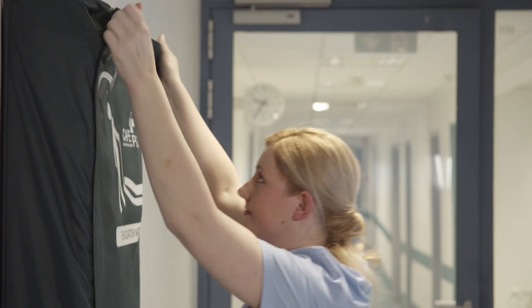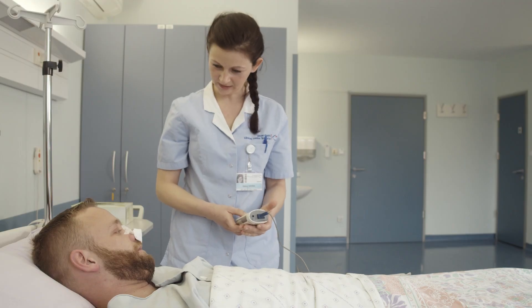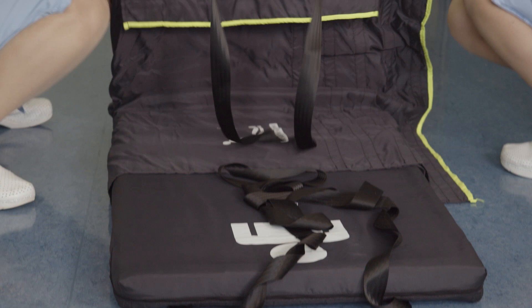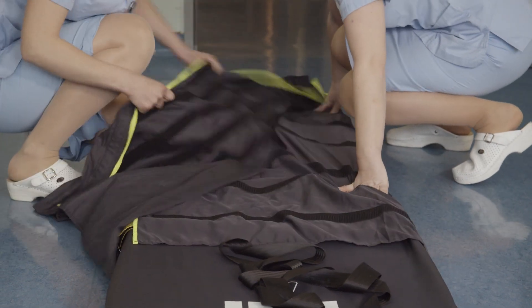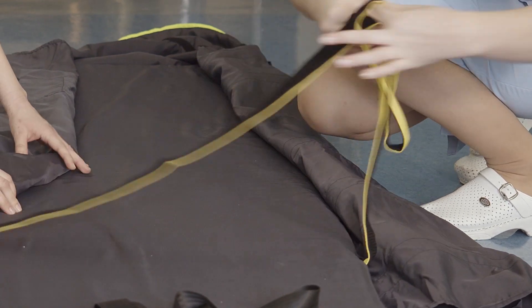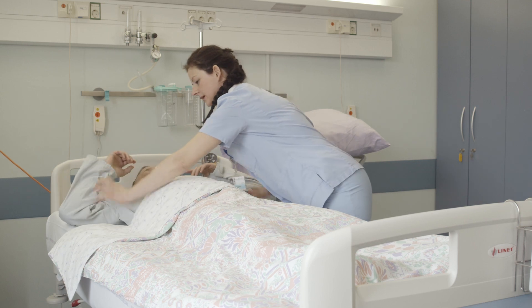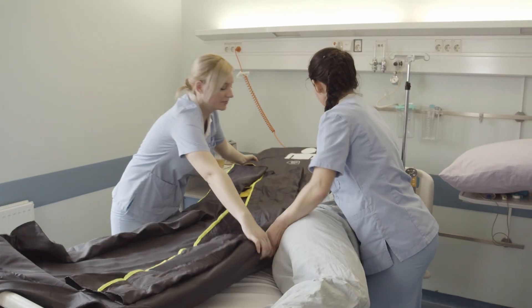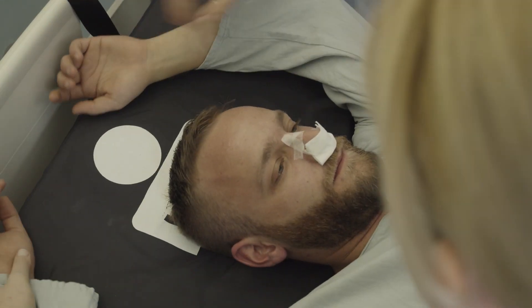Take the evacuation mat out of the storage bag. Unfold all sides of the evacuation mat and unfasten the yellow waist belt. Place the patient in the middle of the mat according to the outline on the mat. The head should be approximately 20 centimeters from the edge of the mat.